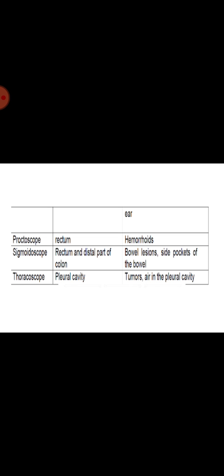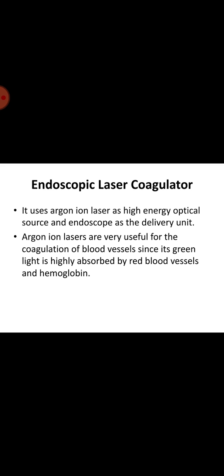Risks depend on the area that is being examined, and the risks of endoscopy may include oversedation, although sedation is not always necessary, feeling bloated for a short time after the procedure, mild cramping, and a numb throat for a few hours due to the use of local anesthetic. Infection of the area of investigation most commonly occurs when additional procedures are carried out at the same time. The infections are normally minor and treatable with a course of antibiotics.